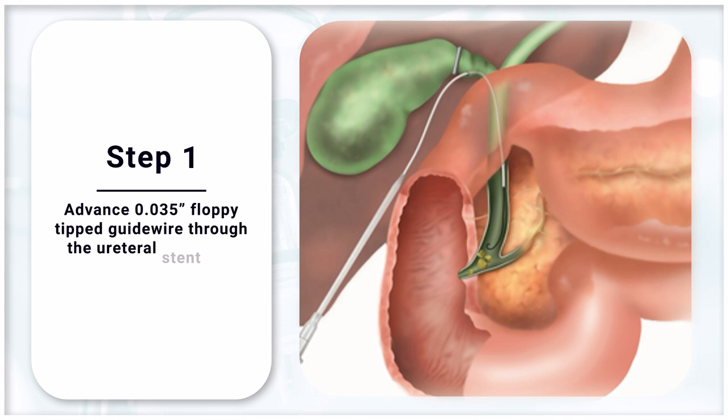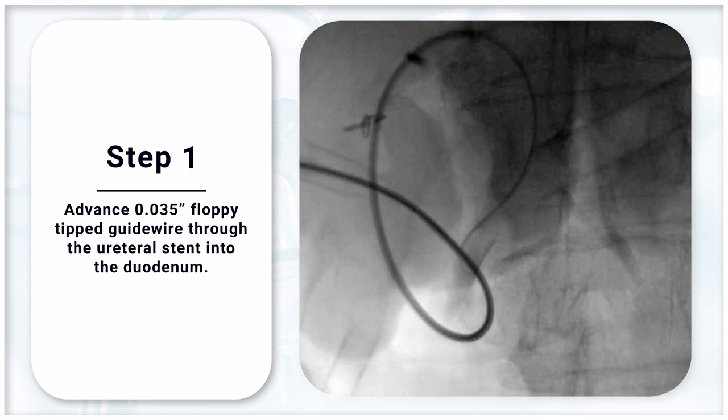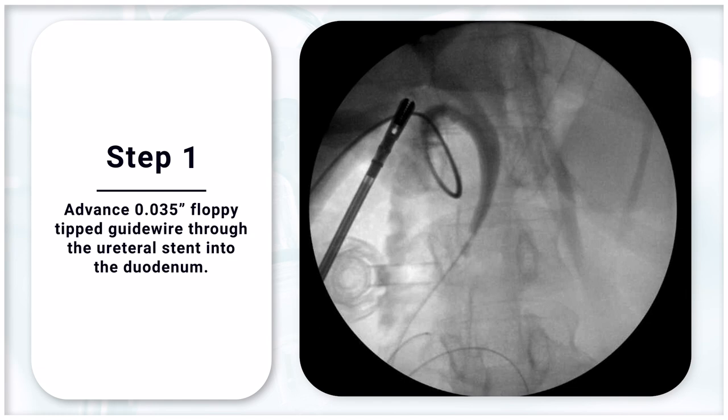Step 1: Advance a 0.035 floppy tip glide wire through the ureteral stent into the duodenum. This glide wire should be advanced a significant amount, as it is very easy to lose wire access with a slick hydrophilic glide wire that is tensioned by the various twists and turns of the biliary tree.